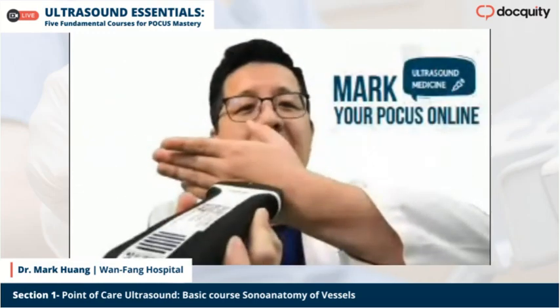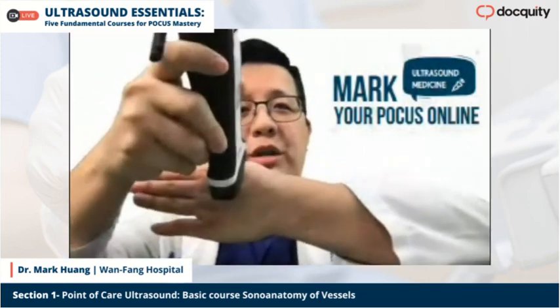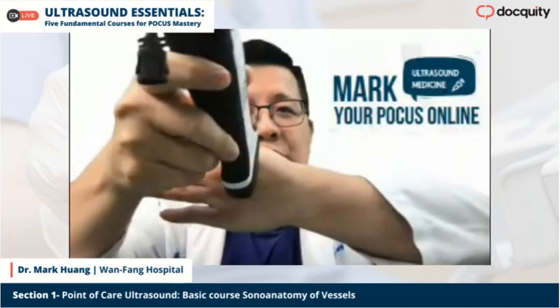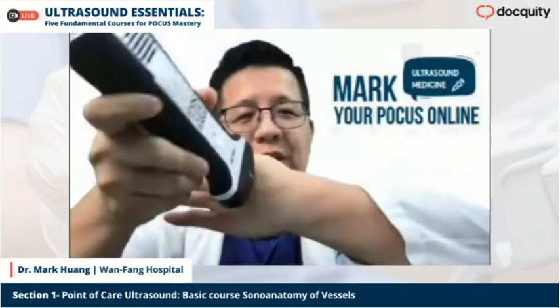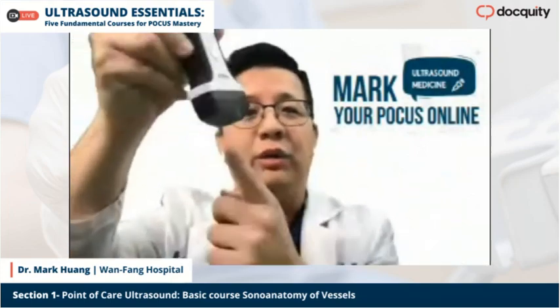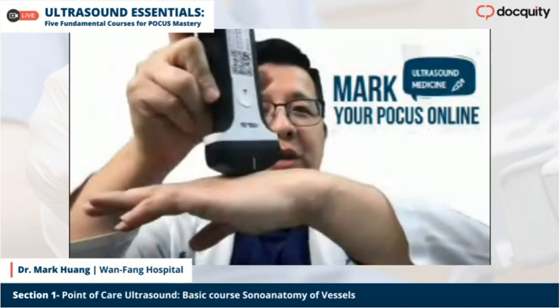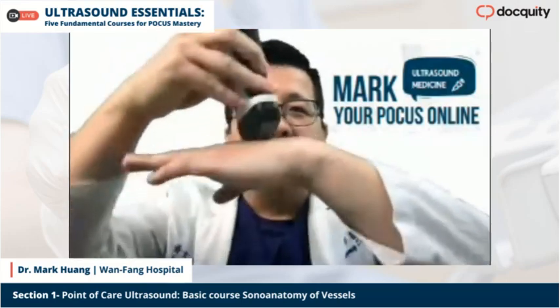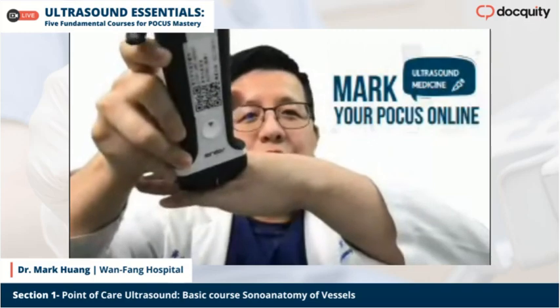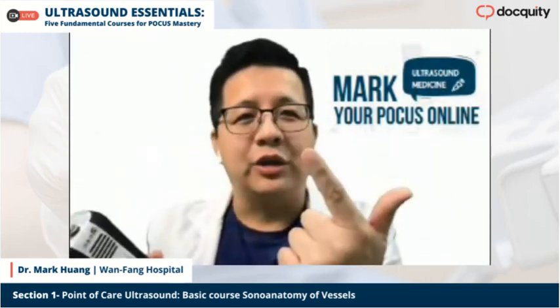The other thing is tilting. When you put the lesion in view, you go along the short edge and try to tilt. Rotating is very simple: just follow your central point and rotate. Don't do it like this, because then you do two manipulations, sliding and rotation.